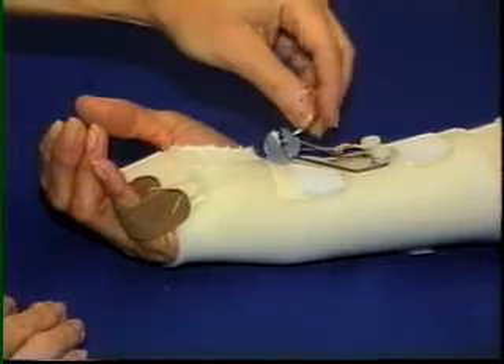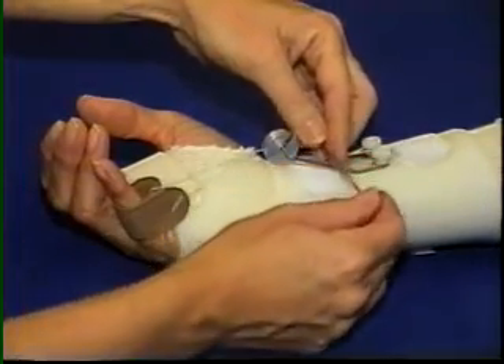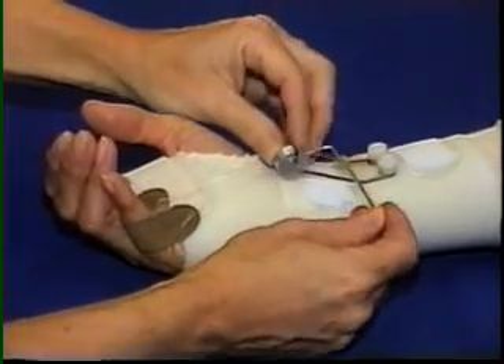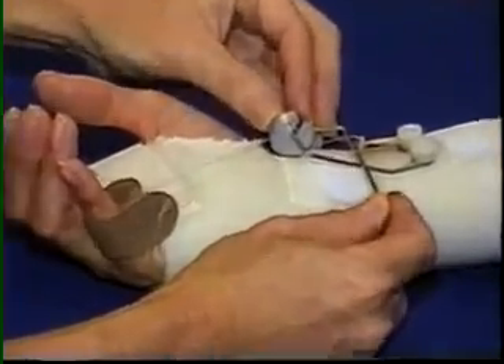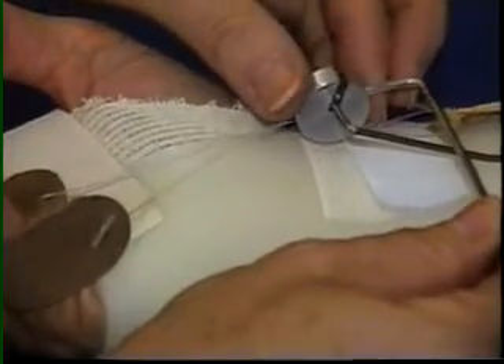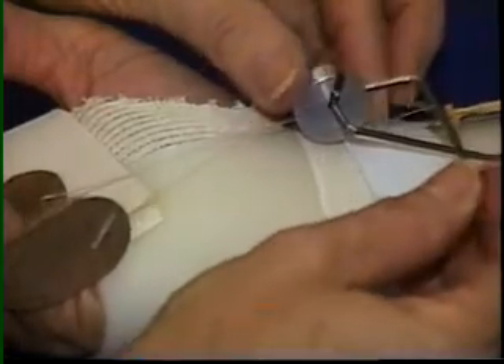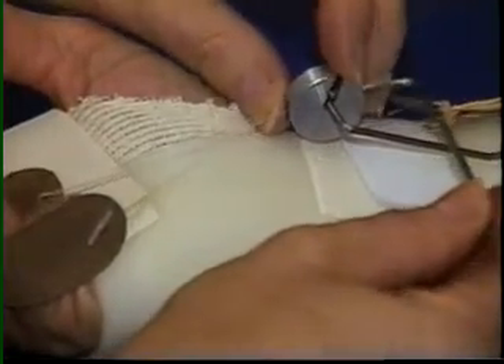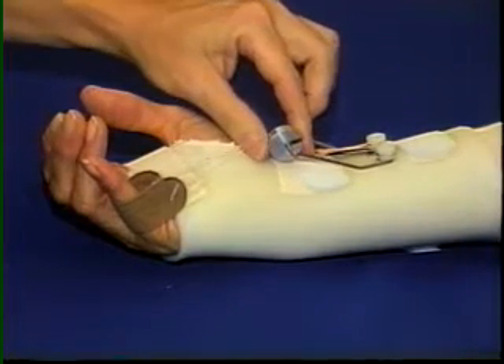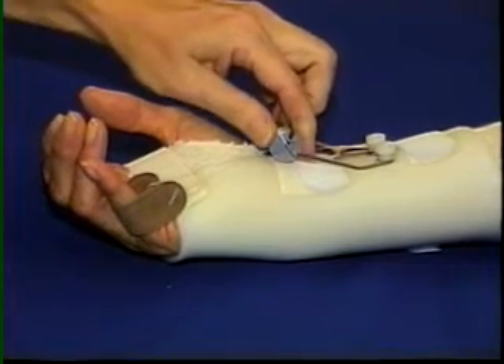The hex wrench is used to release the set screw. The wheel is adjusted laterally so that the appropriate oblique angle of flexion is maintained. The wheel also rotates 3 to 4 inches to maintain a 90-degree angle of pull as range of motion improves. The completed splint is lightweight, comfortable, and stable on the hand. The amount of dynamic tension and the angle of pull is easily modified as range of motion changes.